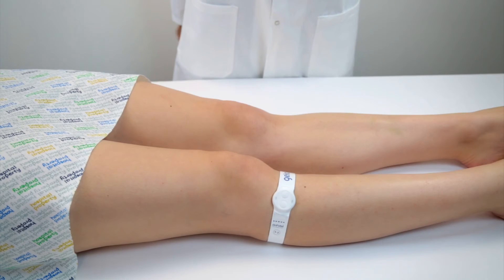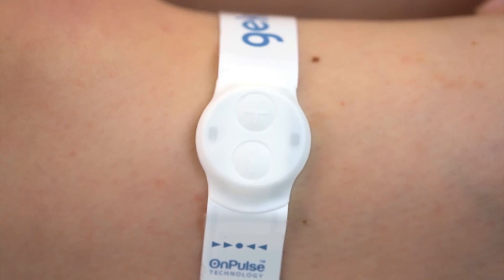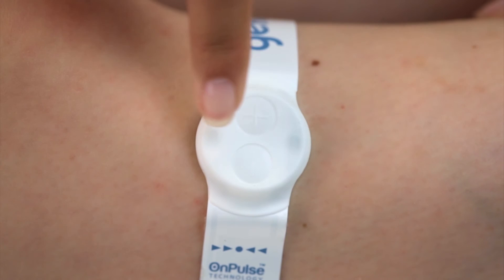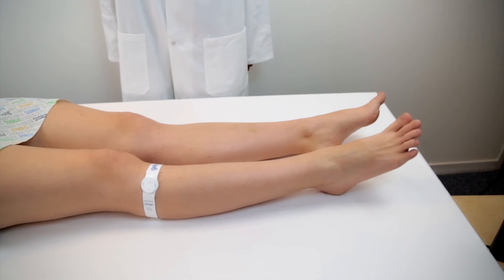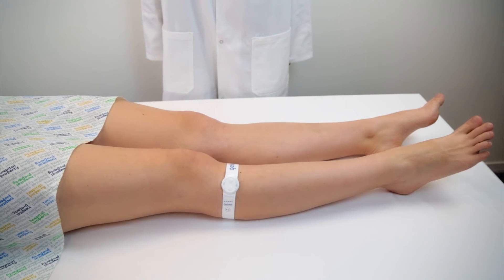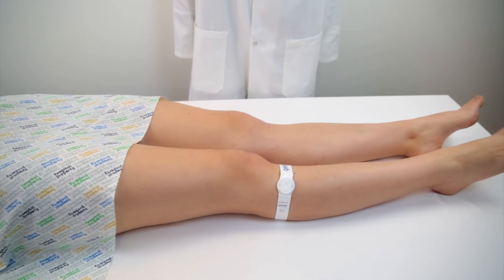Once in position, use a short press of the plus button — 0.5 seconds — to activate the device. The device will start once the button is released. Use further short presses to set the appropriate level, reached when there is a slight visible movement of the muscles in the lower leg, moving the foot outwards and upwards slightly. To accommodate any variation in stimulus due to leg position changes, simply turn the setting up or down.